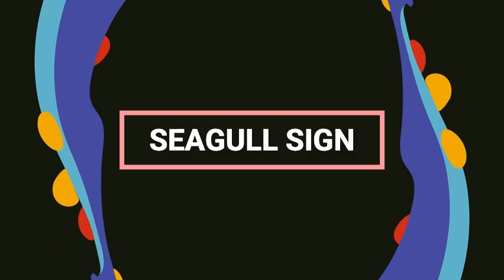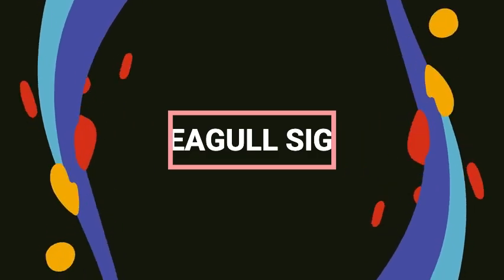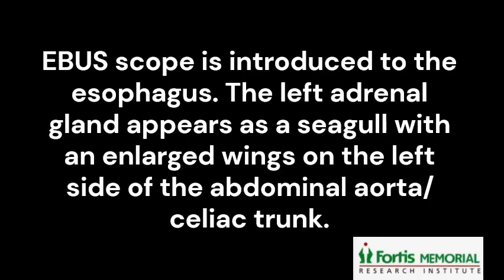Seagull Sign. The EBUS scope is introduced to the esophagus. The left adrenal gland appears as a seagull with enlarged wings on the left side of the abdominal aorta/celiac trunk.